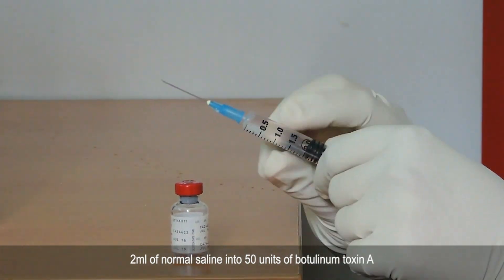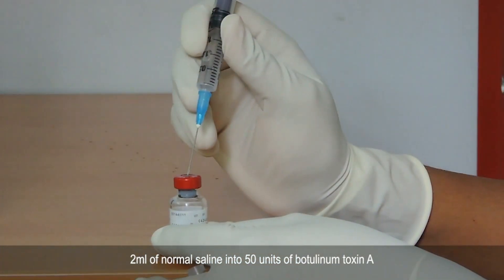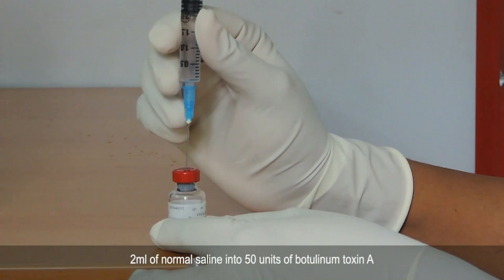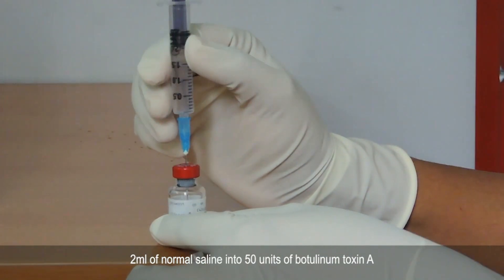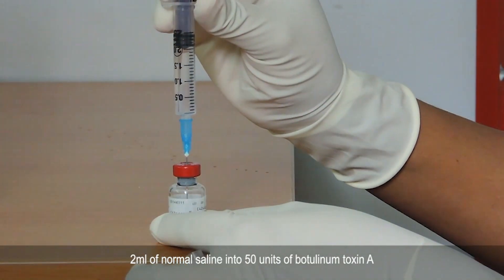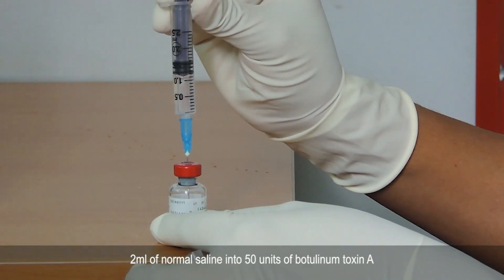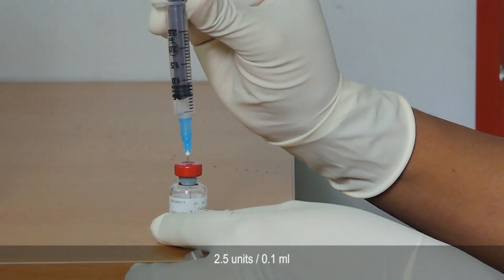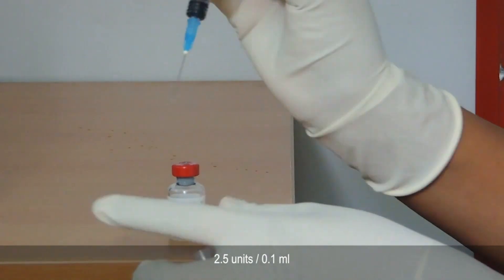Botulinum toxin, available in dry form, is reconstituted with normal saline. 50 units of botulinum toxin type A is reconstituted with 2 ml of 0.9% sterile saline solution to yield a concentration of 2.5 units per 0.1 ml.